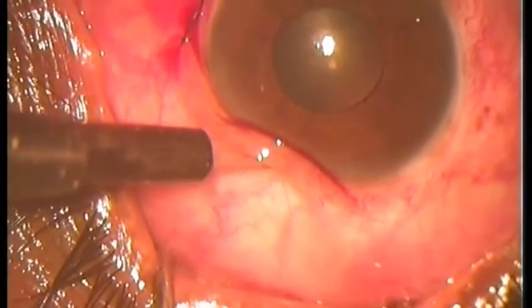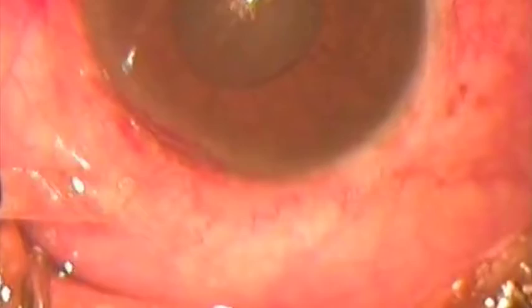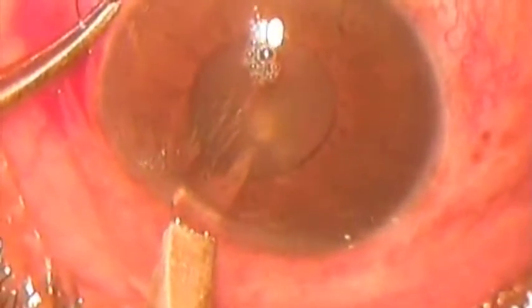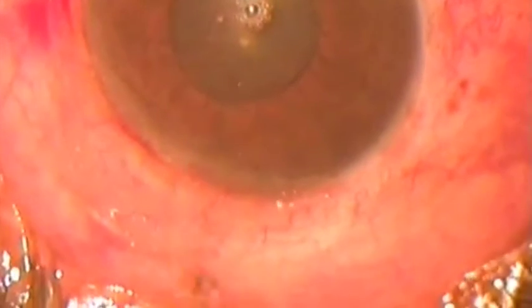Make two tracks with Fugoblade 200-micron tips. The fluid starts moving, but not so well. We have to do an iridectomy — open the anterior chamber and contract the pupil.